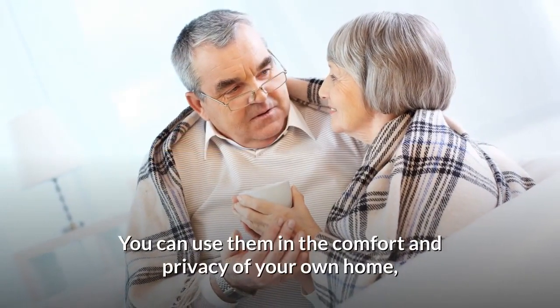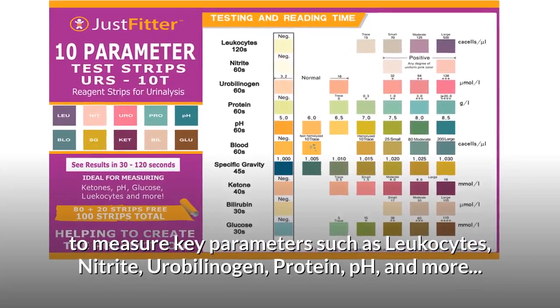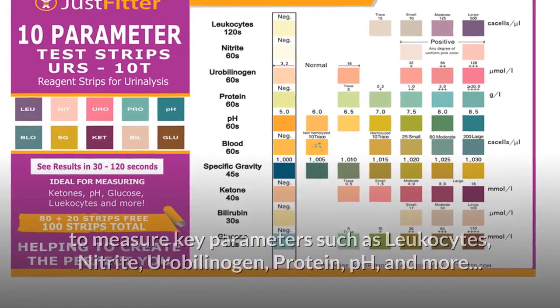You can use them in the comfort and privacy of your own home to measure key parameters such as leukocytes, nitrite, urobilinogen, protein, pH, and more.